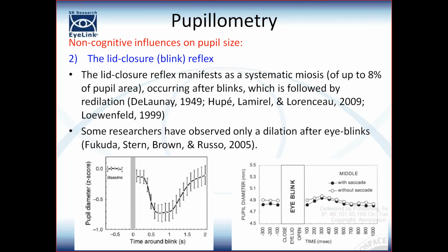Eventually there will be so little of the pupil left that the eye tracker can no longer compute its center, and the eye tracker will then signal a blink. But that point will be reached after 10, 20 samples, during which the eyelid has been descending over the pupil, resulting in a rapidly decreasing pupil area signal, and actually resulting in a downward shift in the center of the visible pupil that is sufficiently fast, has a sufficiently high velocity, that it will actually trigger the saccade parser in the eye tracker. So you will find that all of your blinks are actually wrapped in what are, in many cases, artificial saccades. This is another thing we're going to look at.